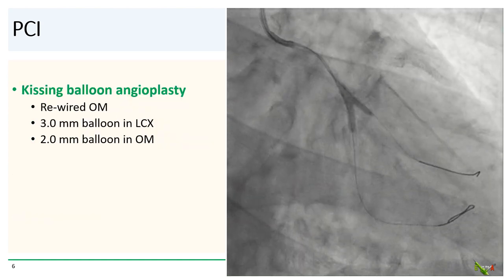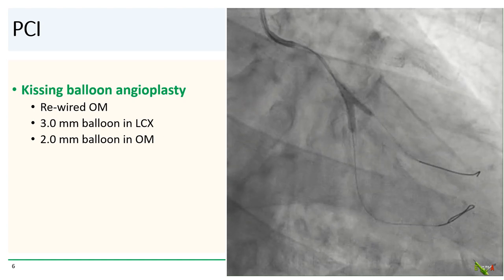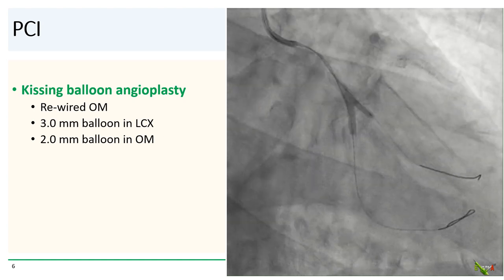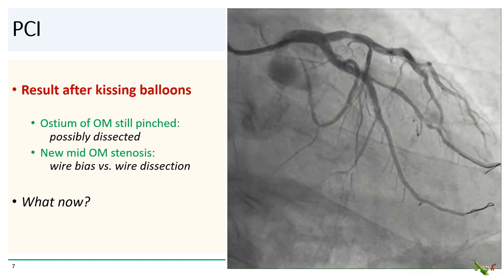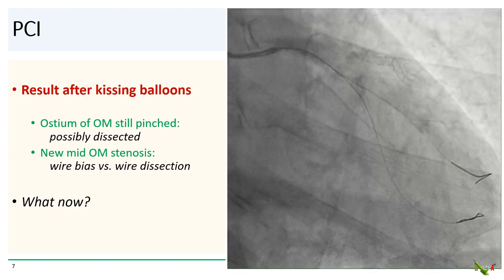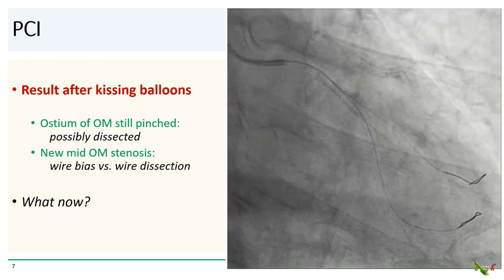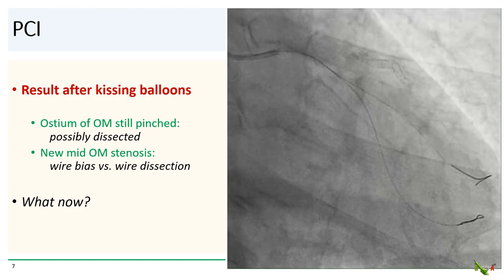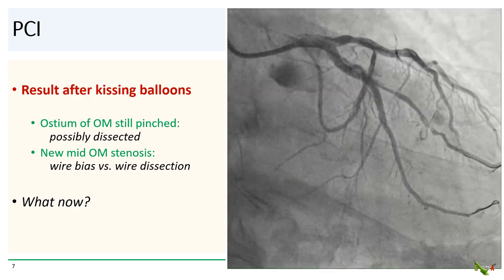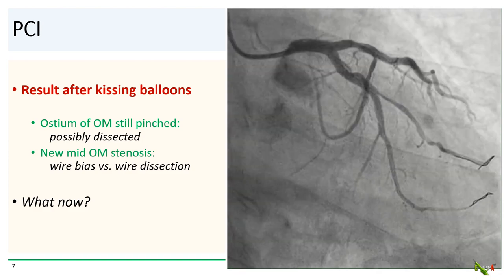We decided to go ahead and balloon the OM. We rewired the OM through the circumflex stent and performed kissing balloon angioplasty at the bifurcation. After kissing balloon angioplasty, the result unfortunately was not much better — if anything, the OM looked worse. The ostium is still pinched and now possibly dissected. There is also a new stenosis in the mid-OM, which could be wire bias or wire dissection.